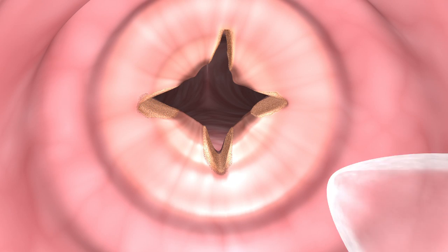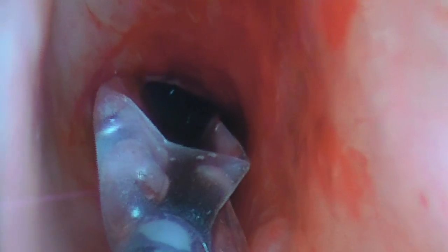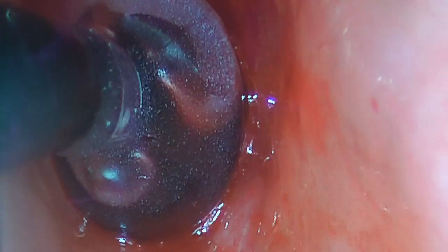Laser incisions are really relaxing incisions for the dilatation. Dilatation is extremely important, but the laser and the dilatation makes the difference. The balloon is less traumatic, and we do not have to remove the laryngoscope to apply the balloon. So the airway is still maintained, except for that immediate time period when the balloon is used.